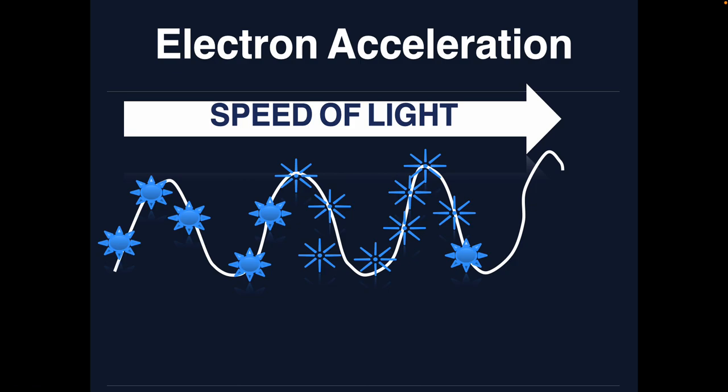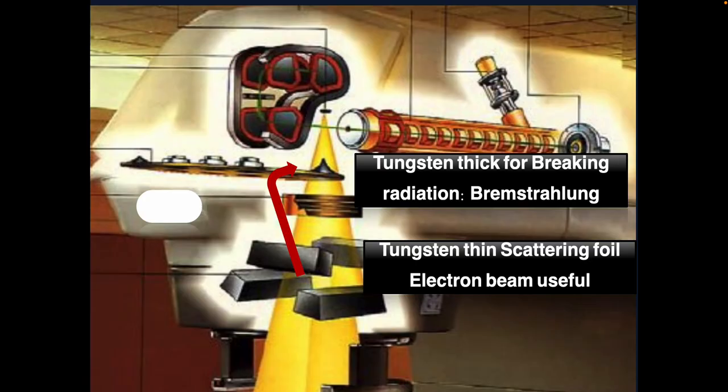At a certain point, we release the electron outside the accelerator tube, and it gives us what we call the high energy electron beam. And then you bend it through the magnet and magnetic head, and there are different ways of moving or directing your electron beam.